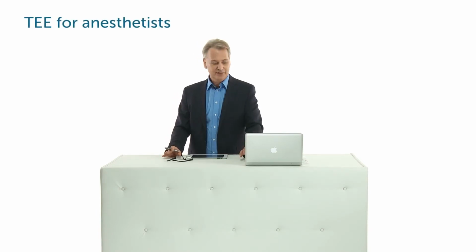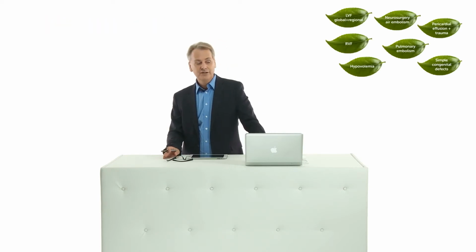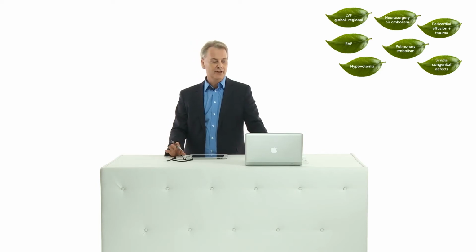So far, I've been focusing more on patients who cardiologists investigate with the TE. But for some time, anesthesiologists have also discovered the TE. And the associations of the anesthesiologists have put forward a number of different indications where it is important for them.